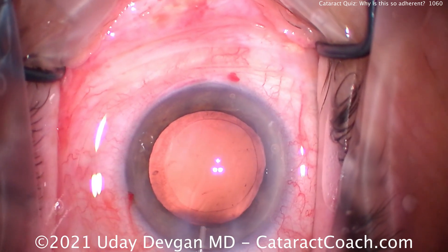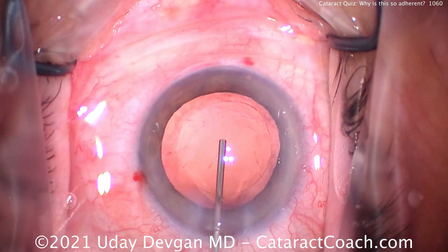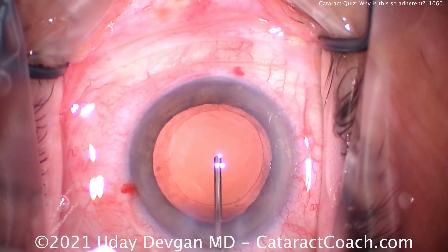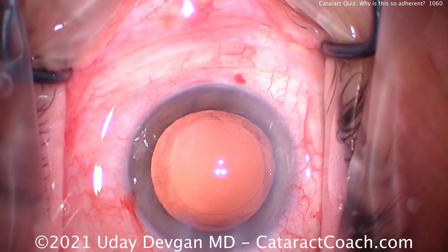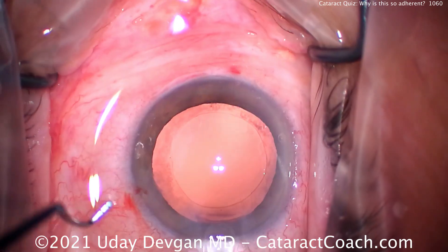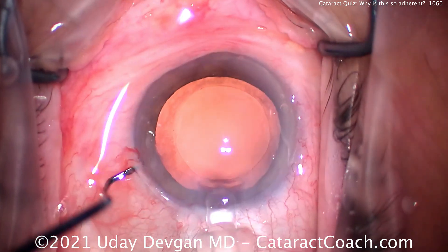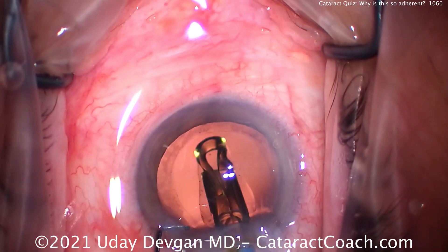Let's fill the capsule bag with our cohesive viscoelastic — injecting that into the capsule bag. We're going to go ahead and clean up the undersurface of the anterior capsule rim to polish that for any lens epithelial cell matter. But first, let's put the lens in the capsule bag. So let's fixate the eye — here comes the lens, delivering it right into the capsule bag.